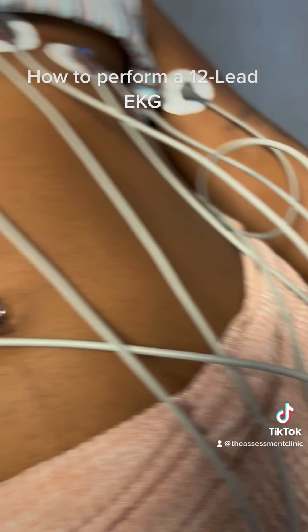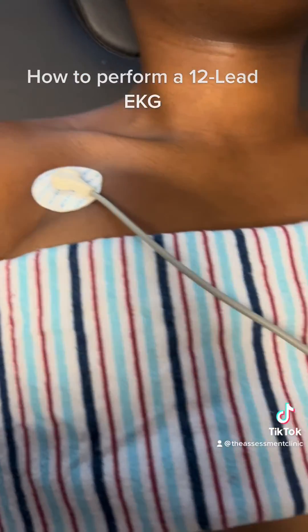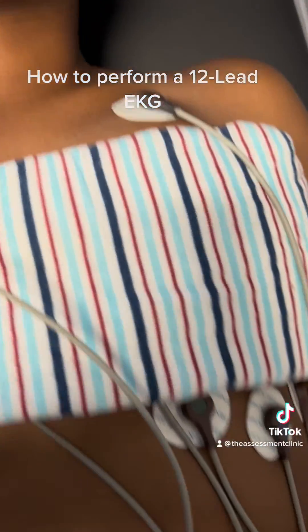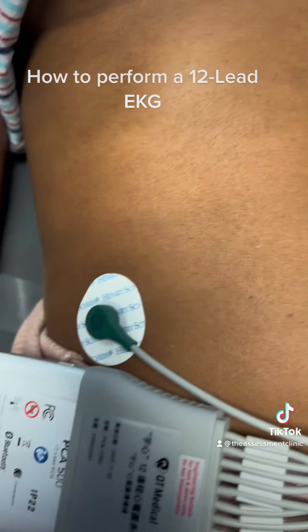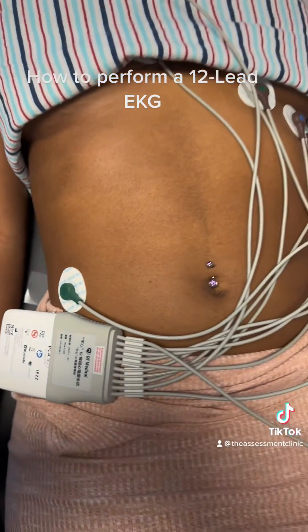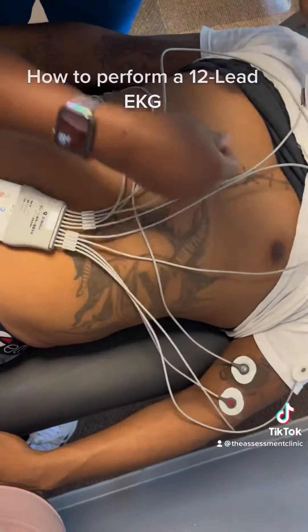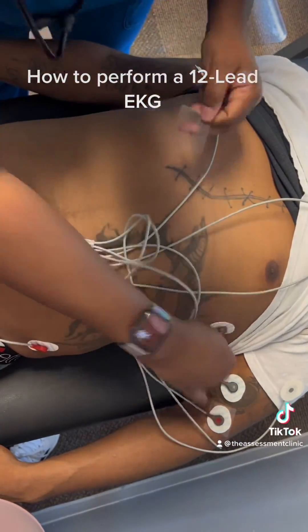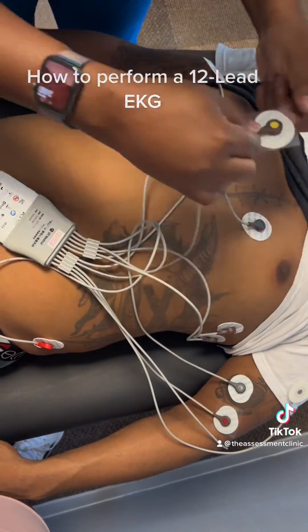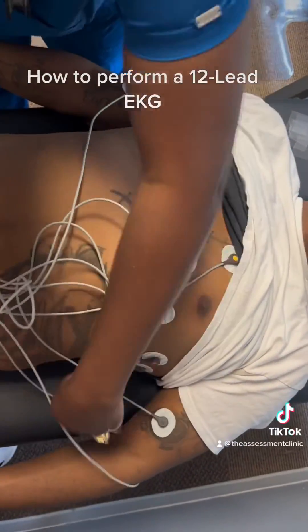In the event that your patient may not have any arms or legs, you can complete a modified EKG, placing the upper leads on the upper chest and the lower leads on either side of the flank. Here is a modified EKG being completed on a male, with the arm leads on the arms and the leg leads placed on either side of the flank.